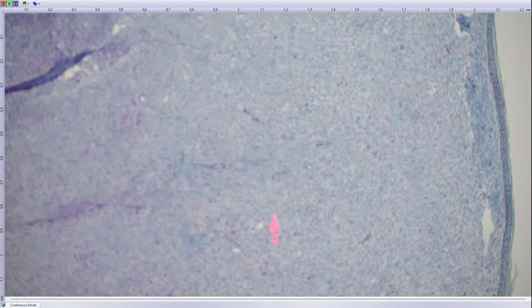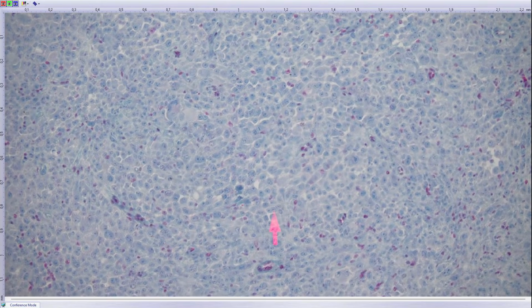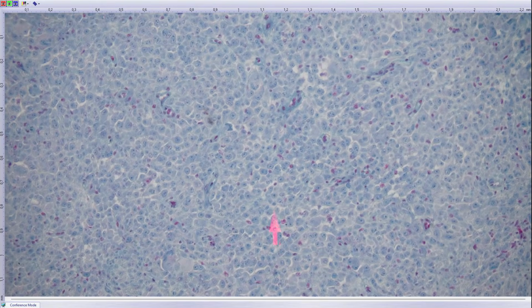And the last thing, the staining for BAP1, and you see it's negative. The positive are hematologic cells, or in the lower part, positive are the original. Here you can see it's BAP1 negative, so that it's BAPoma or BAP1 deficient nevus, but in this case I'm not sure that it's benign.